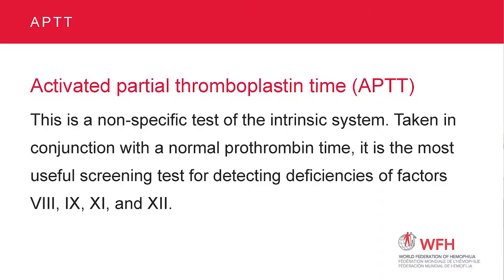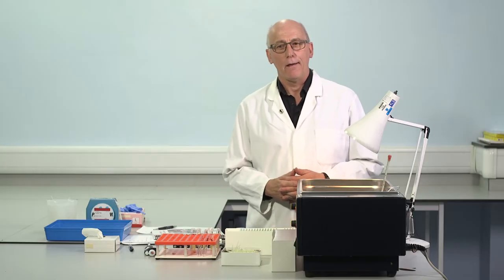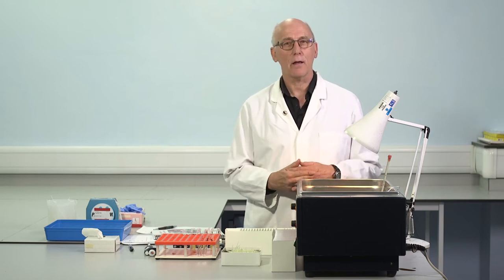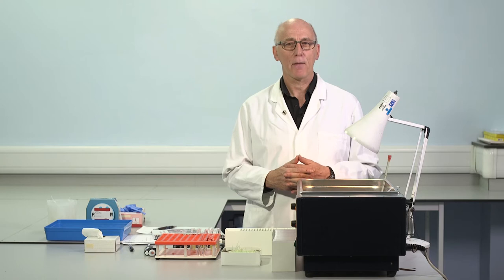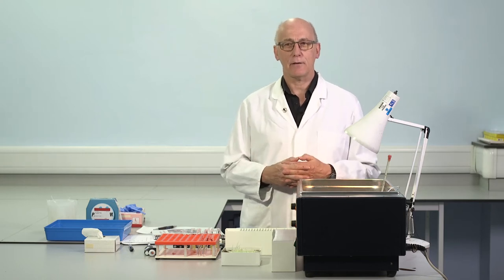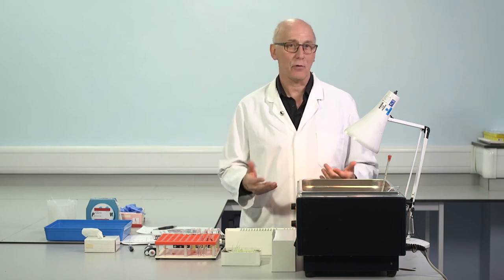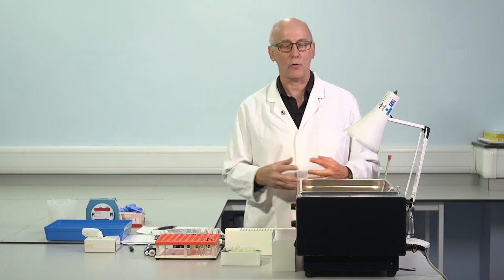So it's our intention to make a demonstration related to APTT testing, because as you know, APTT is a pretty crucial part of our initial investigations in relation to patients with potential bleeding disorders. For the purposes of the demonstration, we'll be working in the water bath, and we'll be working with manual technique. And that's because we recognize that many of us have quite different automation, semi-automated, fully automated analyzers in our laboratories.